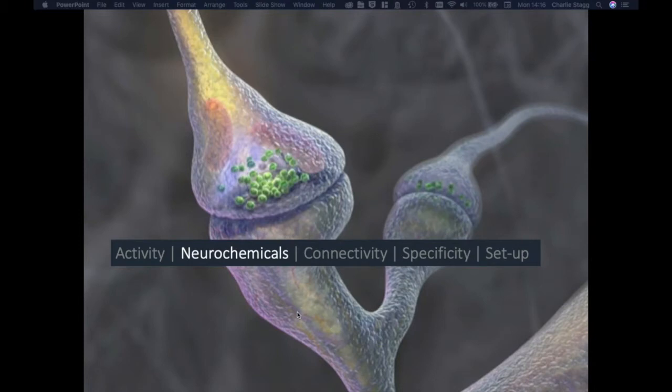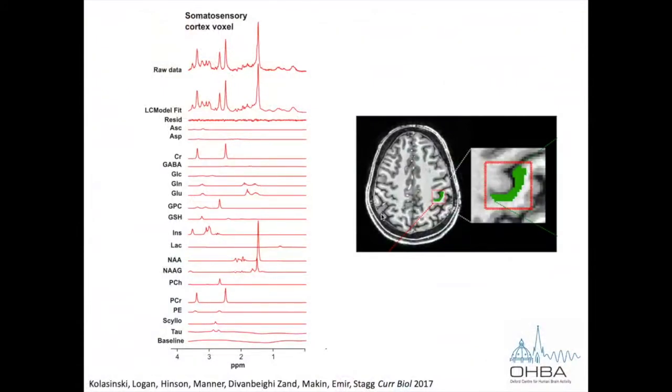Excellent. Fine. So that was the first way of looking at it, to look at areas of brain activity and ask, can we identify areas of brain activity using this combined approach that we can then target in other ways to induce long-term changes. But BOLD doesn't tell us everything. And it doesn't tell us very much about physiology at all. So the other technique that's very close to my heart is using MR to look at neurochemical concentrations using MR spectroscopy. Okay. So what we do here is use MR spectroscopy, which is the original MR technique.